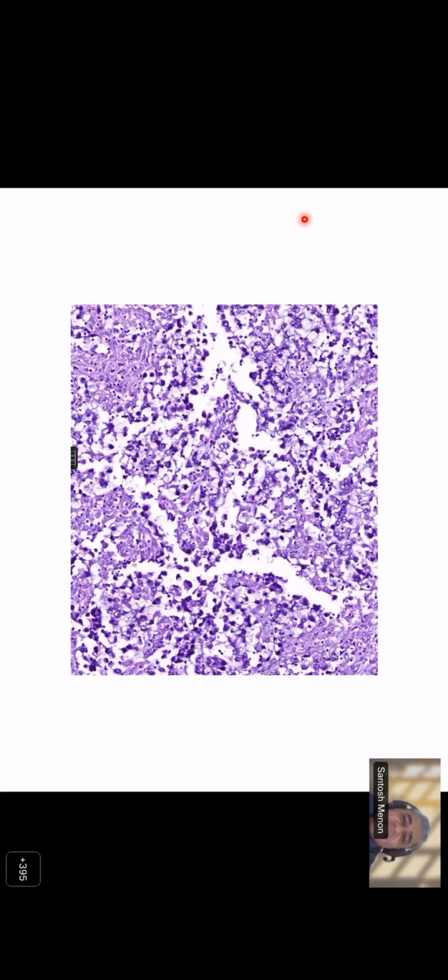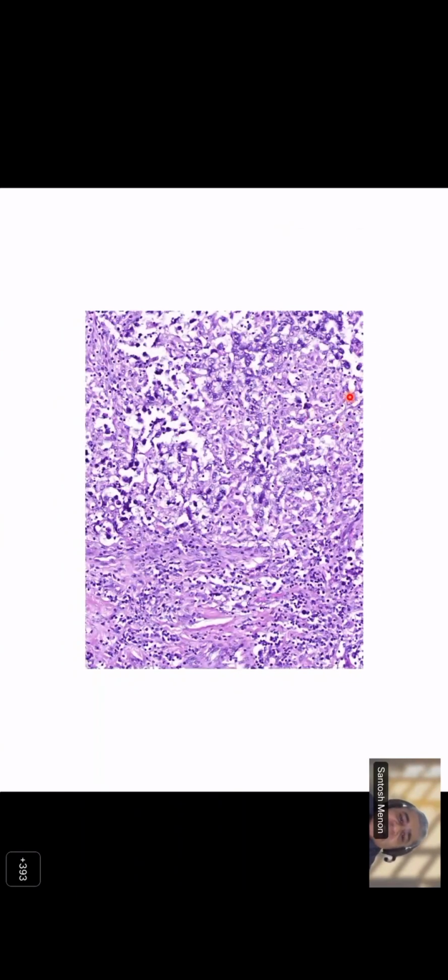But there are other areas where they look very dirty and smudgy. They throw you off totally. Verma sir, you agree? They look very smudgy and dirty at places. Sir, when do we call that overlapping of nuclei then? Overlapping of nuclei in what sense? If any tumor has a lot of cytoplasm, there is very little chance that the nuclei will overlap. Overlapping of nuclei comes when it is a very aggressive and fast growing tumor where there is no contact inhibition, so the cells pile up on each other. But in general, when you have a lot of cytoplasm in any tumor, do you see this? What are these?